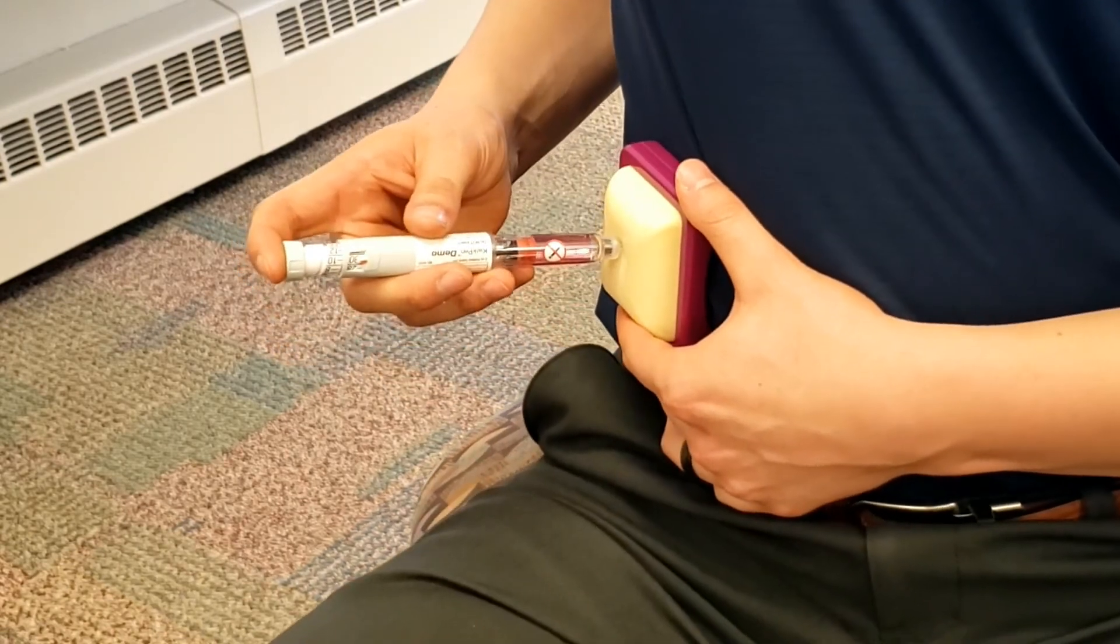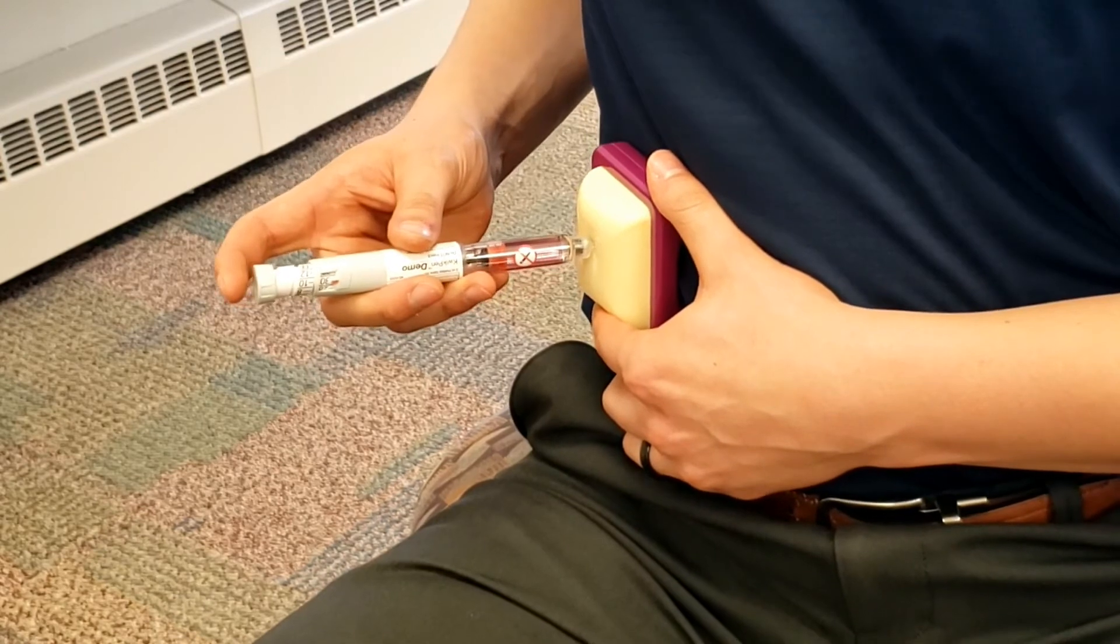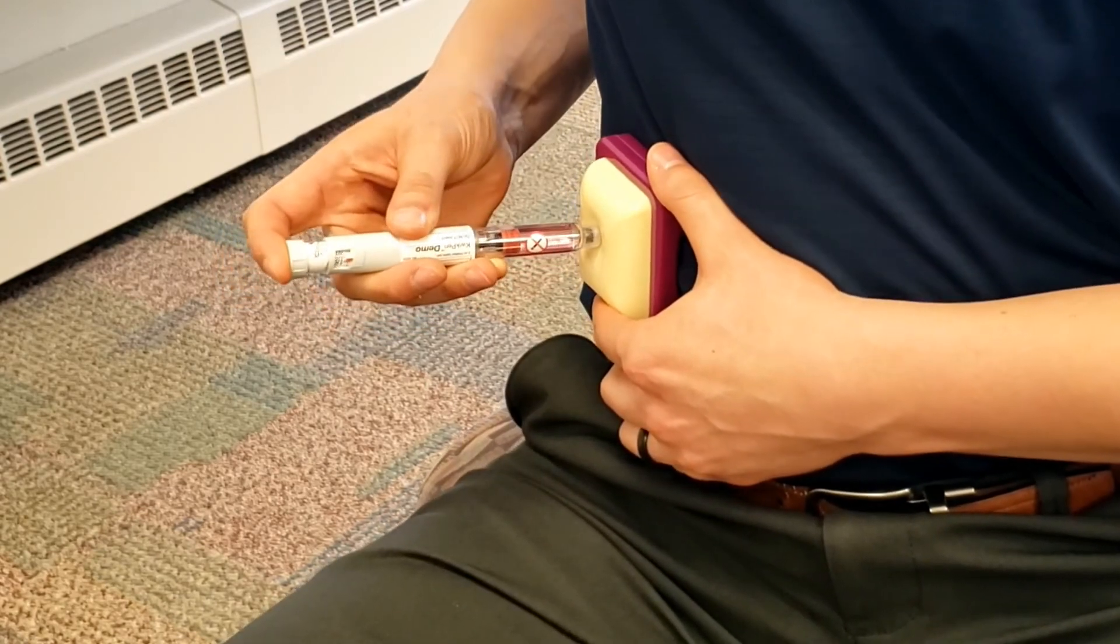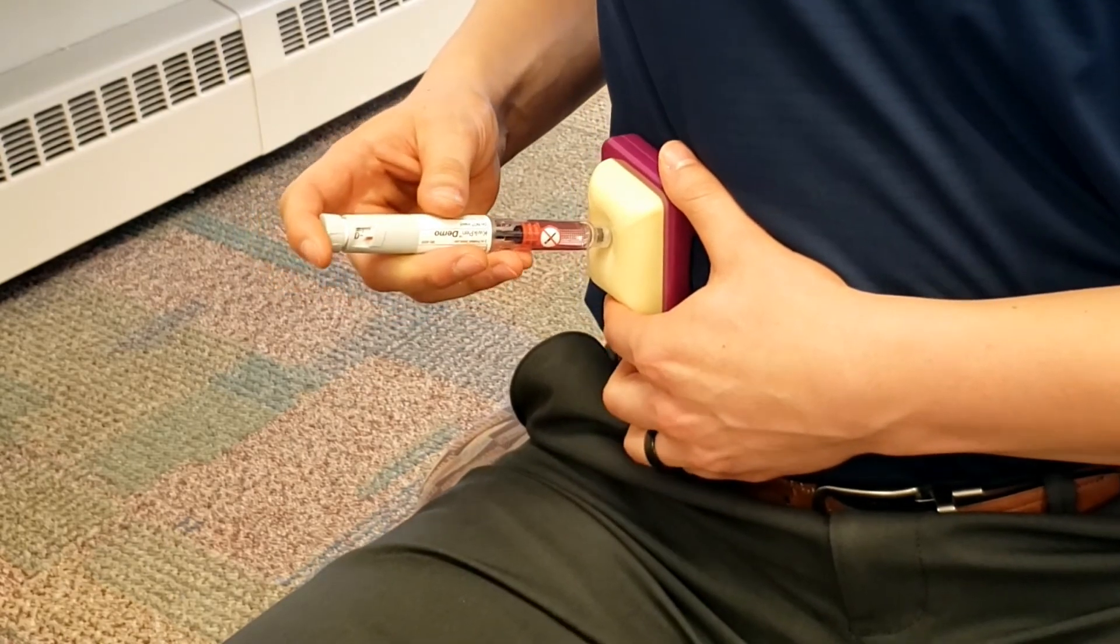Once you have pushed the needle into your skin, push the button on the bottom of the insulin pen all the way in to inject the insulin. Count to 10 before removing the needle from your skin.